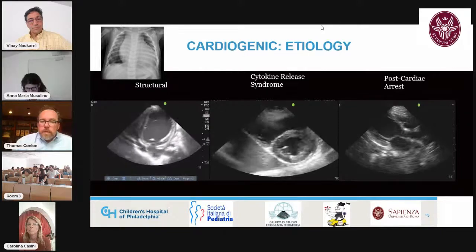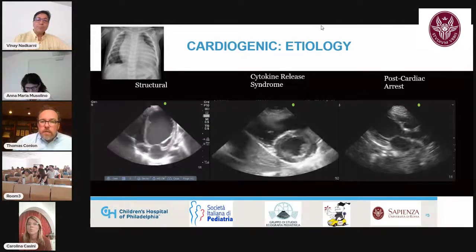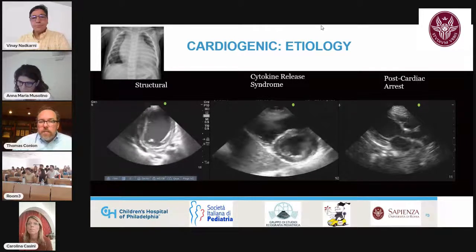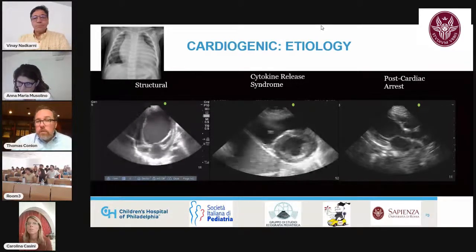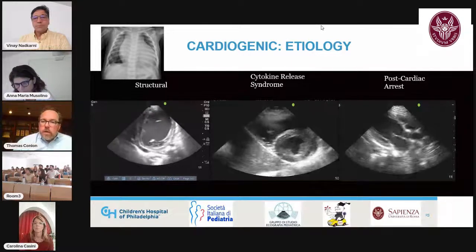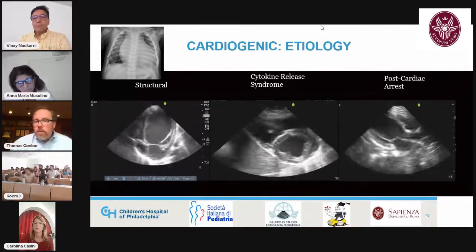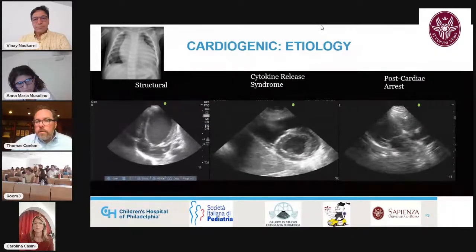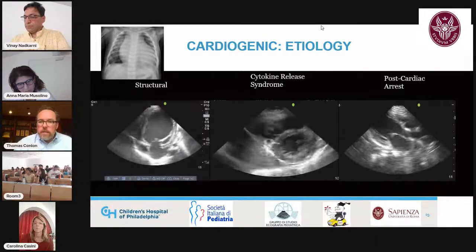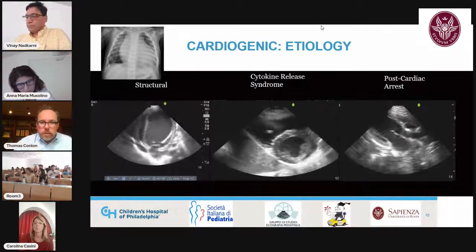Now that we are using novel immunotherapies and targeted therapies for various disease states, we can see myocardial dysfunction from what's called cytokine release syndrome. And we also know that cardiac dysfunction is an important component within post-cardiac arrest. So again, incorporating ultrasound findings with the clinical context of your patient to arrive at an etiology for your cardiac dysfunction.